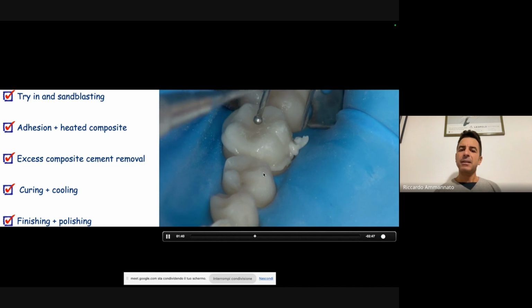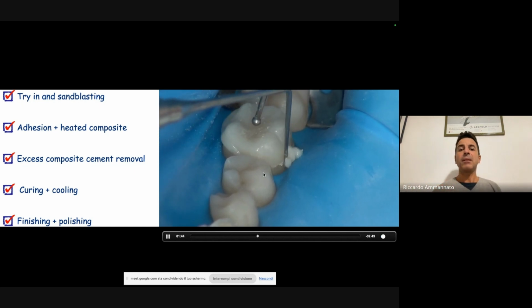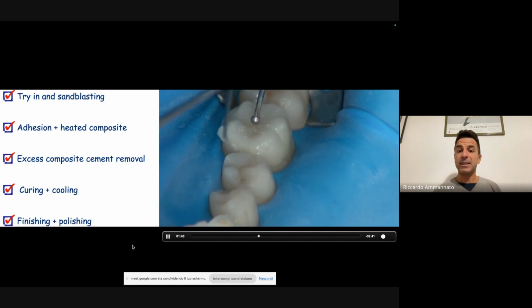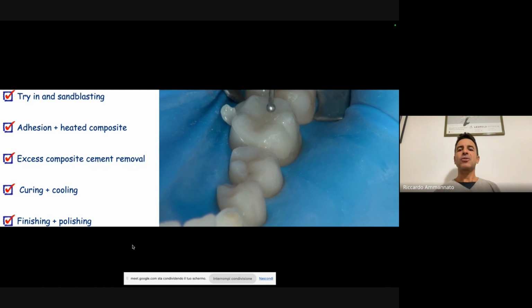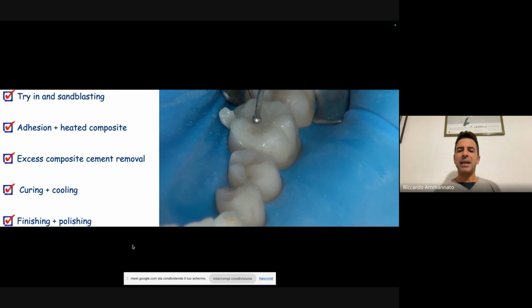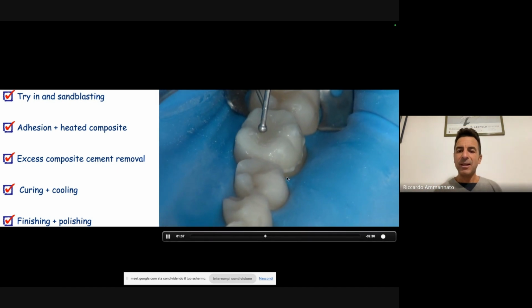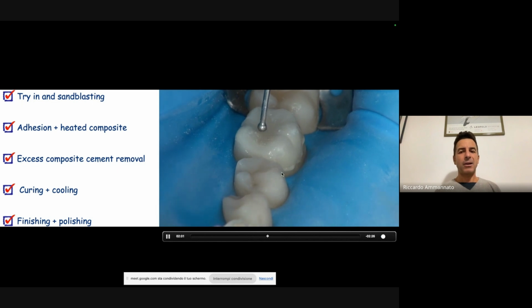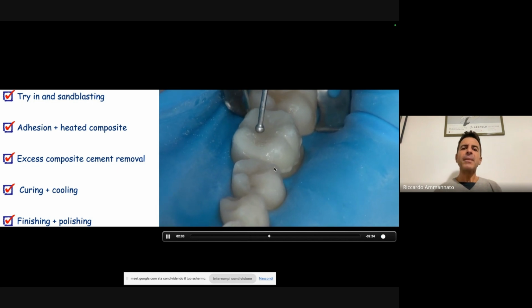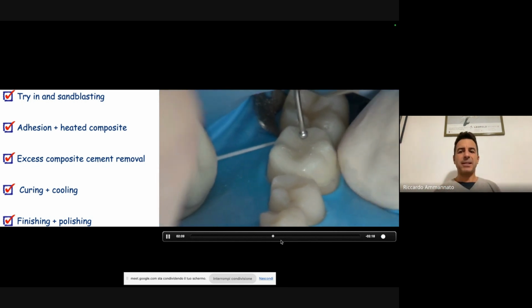I'm going little by little, I don't want to rush. I will decide when the material is going to cure, because it's regular composite, so there's not the chemical part. Little by little, the assistant is pressing down. You see the composite is flowing out little by little, and I will remove it, okay? And when I've checked everything, the assistant keeps pressing down the restoration.